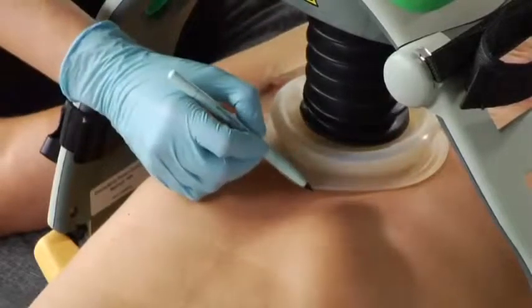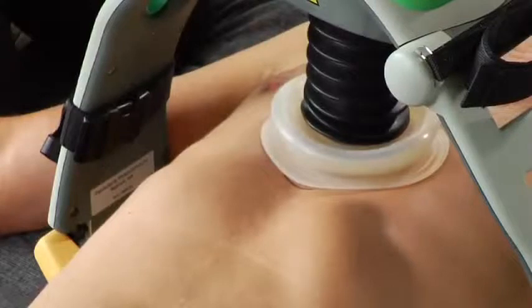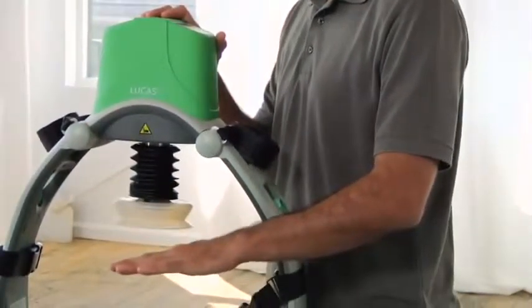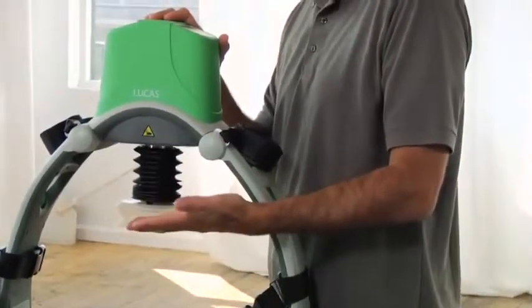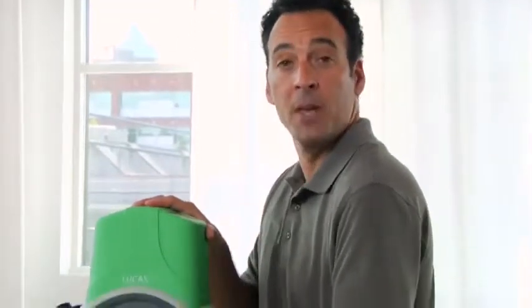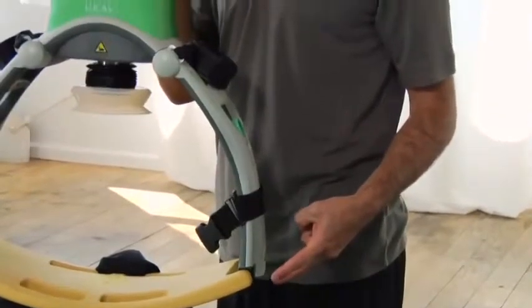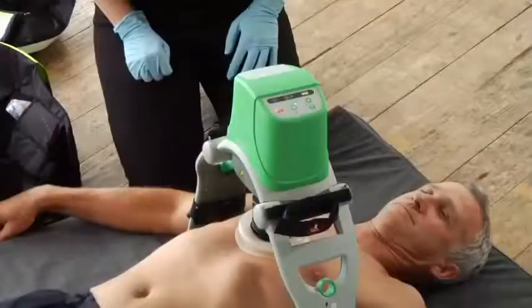You can mark the right position on the patient's skin so you can easily see if the suction cup shifts and you need to reposition it. What you're doing with the pressure pad is setting the upper limit of the compression — it compresses down the same distance every time and then returns to this position. If Lucas alarms with three fast signals when you try to enter pause or active mode, the patient is too small for Lucas. If you can't get the upper part around the patient and secure the claw locks onto the back plate, the patient is too big. Do not try to use Lucas on a patient that it doesn't fit — it won't be effective and you'll have to continue manual compressions.